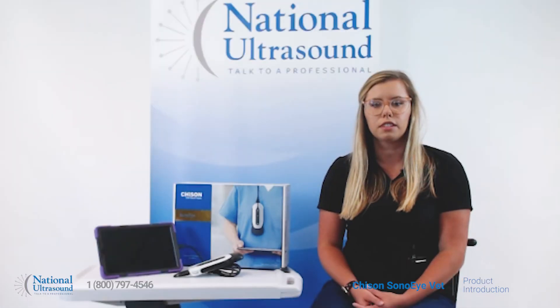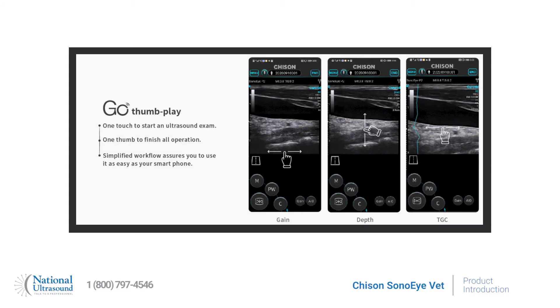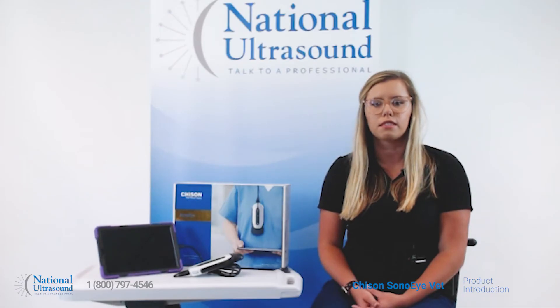Standout features include ease of use. The Chison Sono Eye Vet is extremely easy to use, similar to using your smartphone. With a streamlined workflow and intuitive interface, you can learn to use it in a few minutes. You can operate the system with one hand with the unique three programmable button probe design.